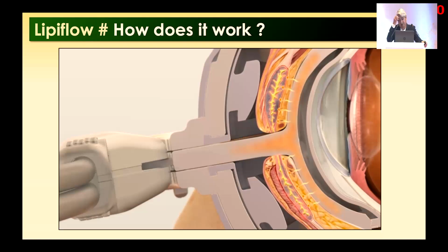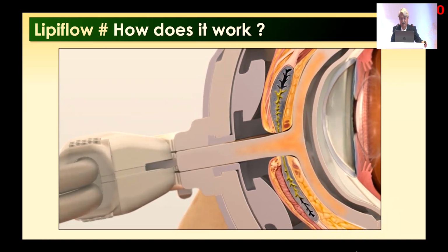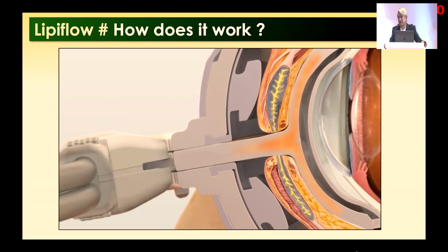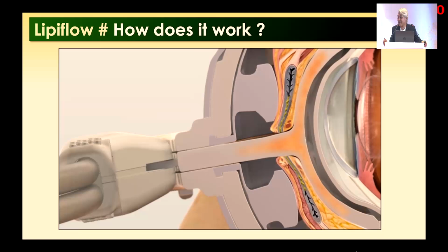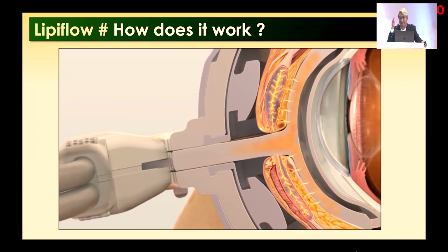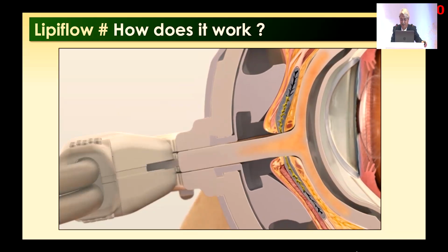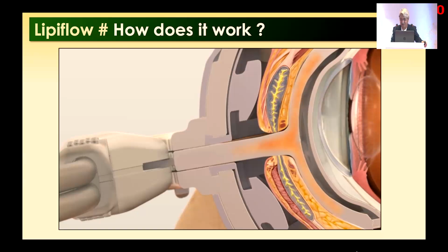This is an animation from them. You see, we call it eye spa, eyelid spa, because when you do it, patients feel like saying, give me more, treat me more, this kind of sensation. It is so soothing. In IPL you have to apply so much cream, and sometimes it is difficult to do that, and sometimes it also burns, and we have seen discoloration of the skin, so we abandoned that.